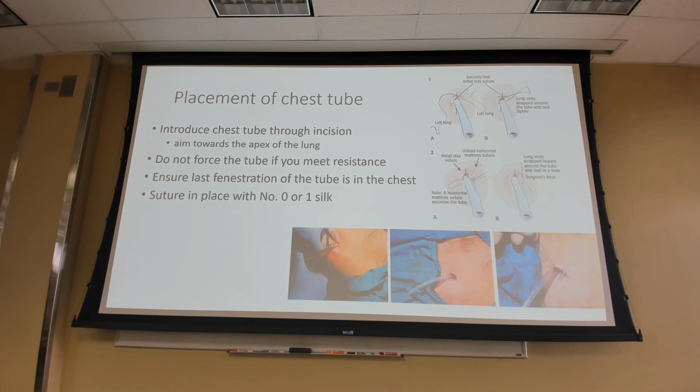When we're checking that chest tube every day, looking at our Pleur-evac and running that line, we're actually placing some traction on the tube. That's why it's important that it's secured in place. Once we suture it, we're going to place multiple dressings and tape the living heck out of it, which we'll talk about in a sec. So the chest tube's usually not going anywhere.